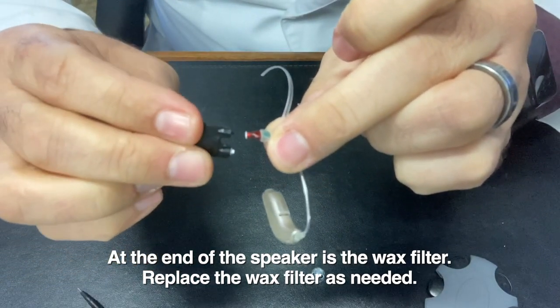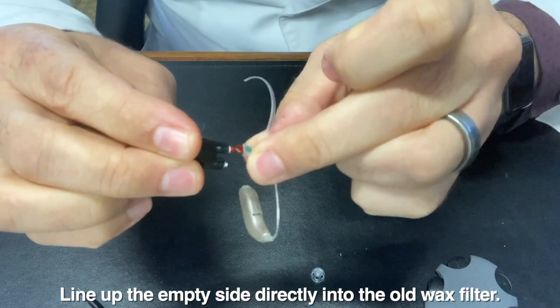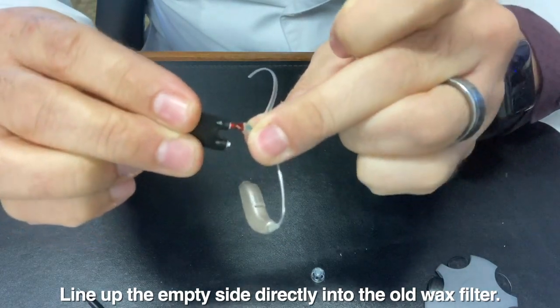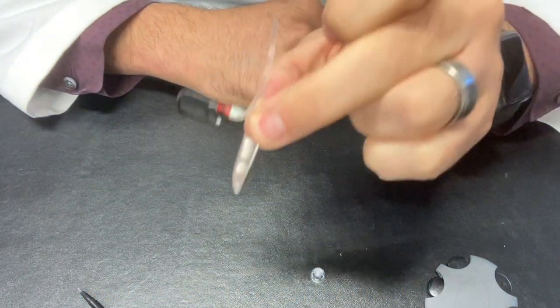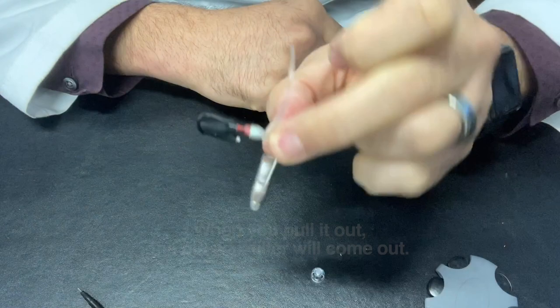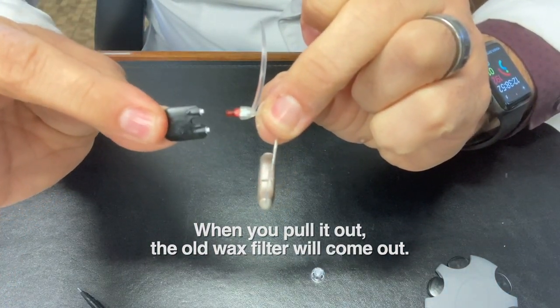You want to line up the empty side directly into the hole. You might even hear it snap. It'll stick in there if you let it. Then when you pull this out, it will take the wax filter with it.